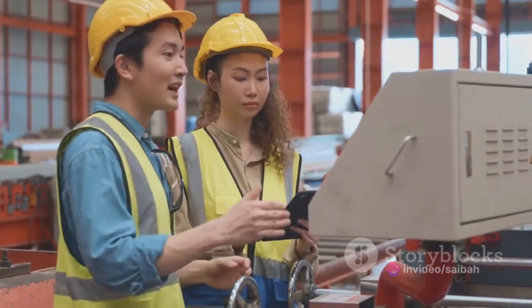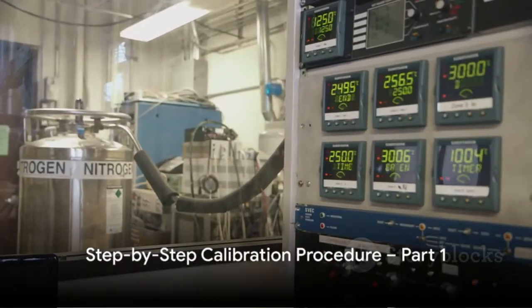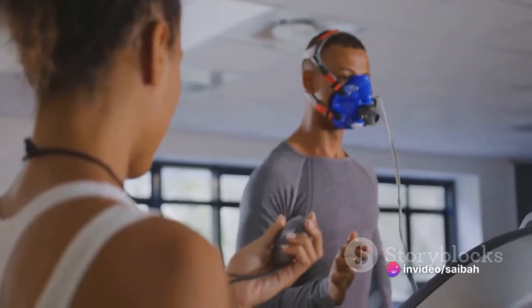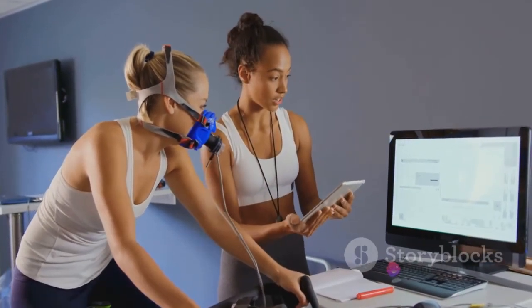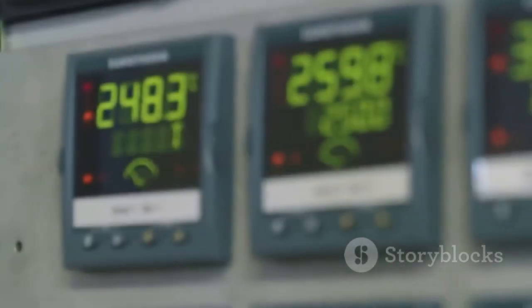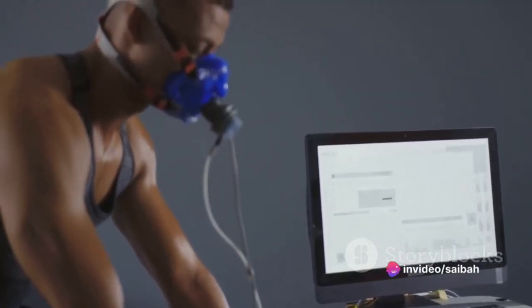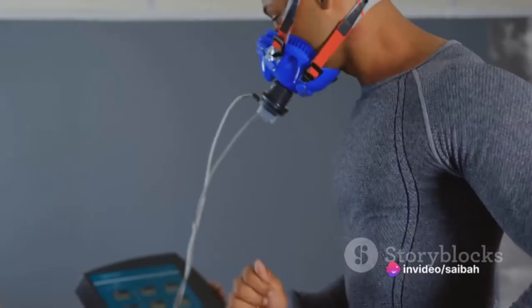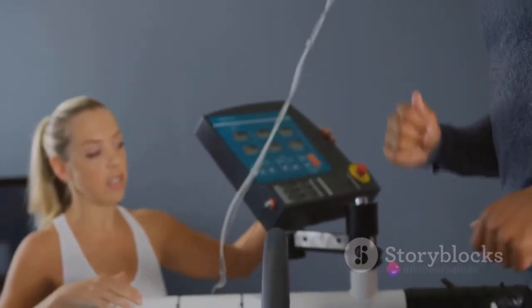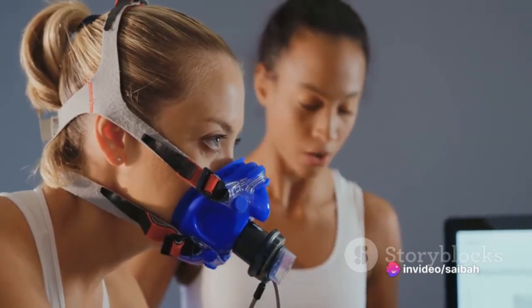The first step in calibrating an oxygen analyzer is to perform a zero calibration. Zero calibration sets the baseline for your device, ensuring it accurately reads the absence of oxygen. For this, we use nitrogen gas. Start by connecting a nitrogen gas cylinder to your oxygen analyzer, using a regulator to control the flow. Ensure there's a good seal between the cylinder and the analyzer to prevent any air from sneaking in. Then open the valve and let the nitrogen flow through the analyzer for about five minutes — this is called flushing — to remove any residual oxygen.